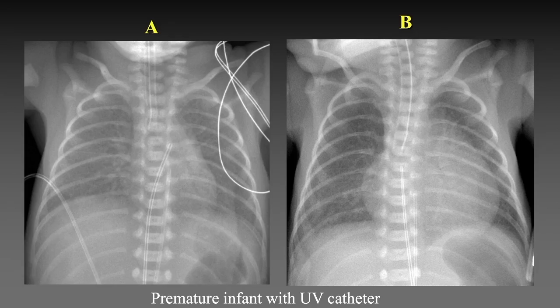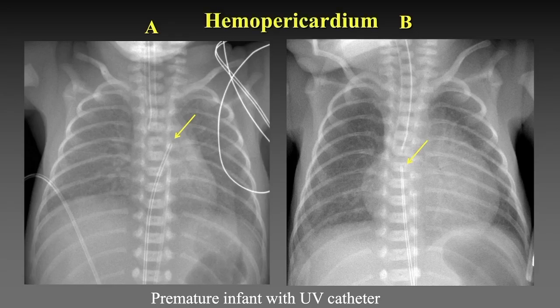This is a premature infant whose umbilical venous and arterial catheters are in place. Notice the position of the UV catheter tip in figure A — it is in the right ventricular outflow tract. It was repositioned and notice the increase in heart size shown in figure B. This infant had a hemopericardium and cardiac tamponade as the result of cardiac perforation.